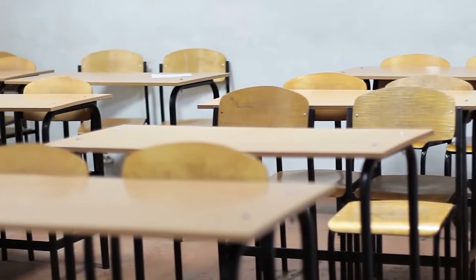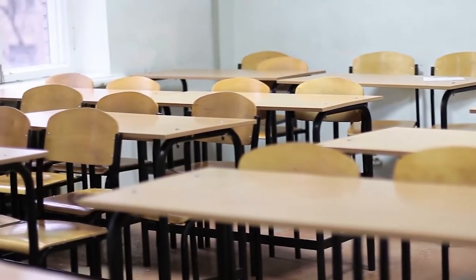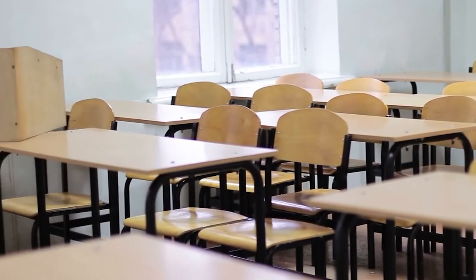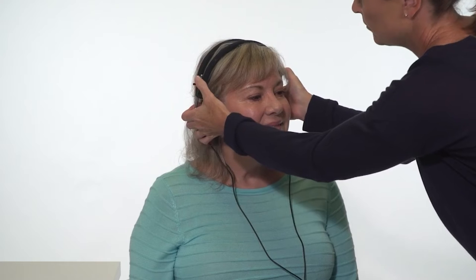The first step is to find a screening location. Look for a quiet location away from distractions such as high traffic hallways, copiers or printers, or windows to a playground. Verify the ambient noise level with a sound level meter, or perform a hearing screening on a normal hearing individual to verify all frequencies and tones can be heard below the screening level.